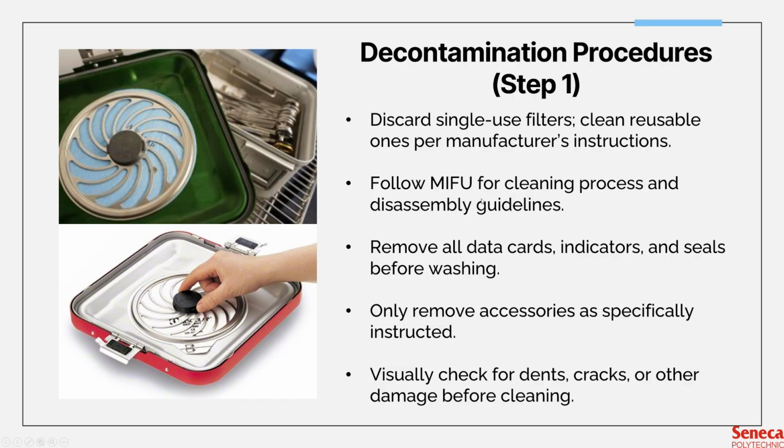Of course, you have to follow MIFU guidelines for disassembly. Some parts like gaskets or valves can only be removed under specific instructions, and for the most part, you as the technician will never have to remove this. I believe only the coordinator or supervisor has the business to open or replace these parts, and even then, we're not really equipped to replace it anyway. If we were to find a broken gasket, we would just send it out for repair and replacement.